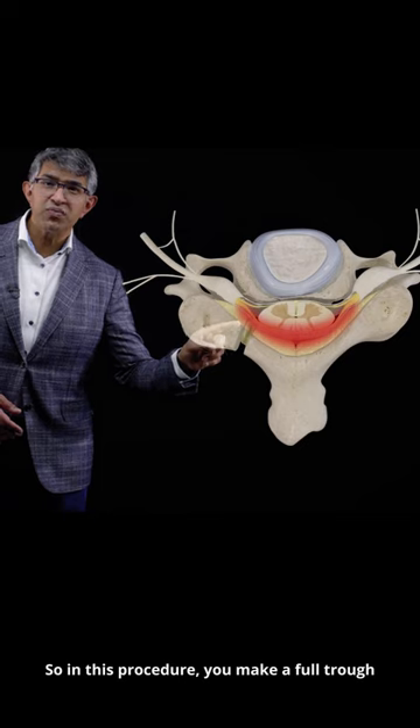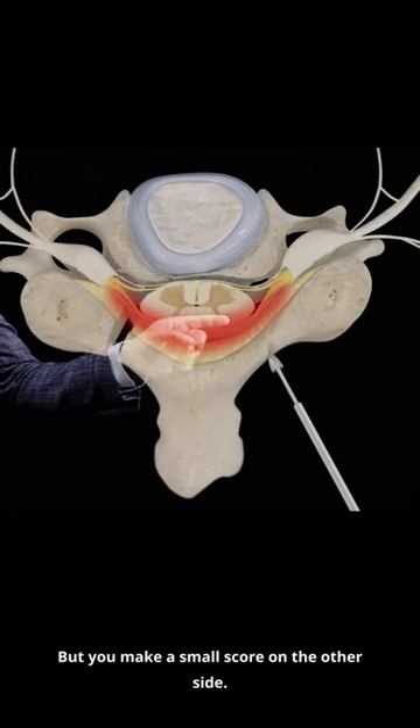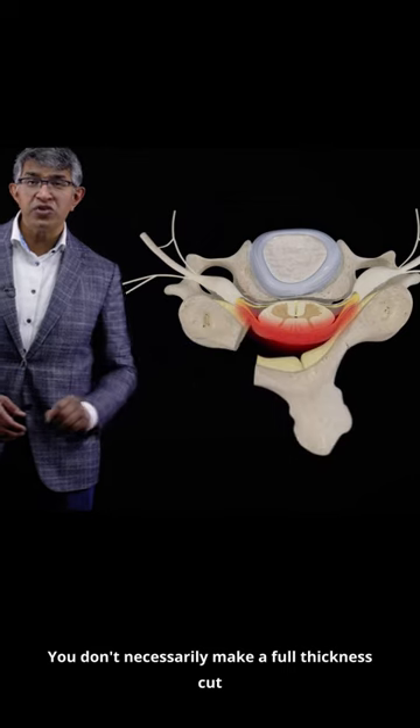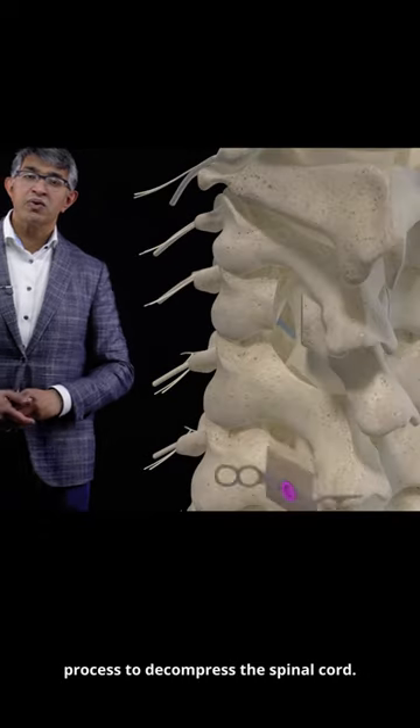In this procedure, you make a full trough here and remove the ligamentum flavum on one side, but you make a small score on the other side. You don't necessarily make a full thickness cut, and then you elevate the lamina and the spinous process to decompress the spinal cord.